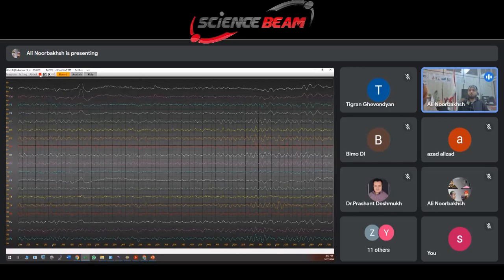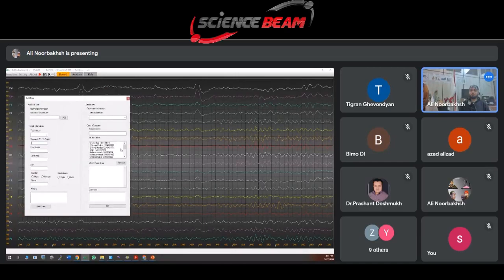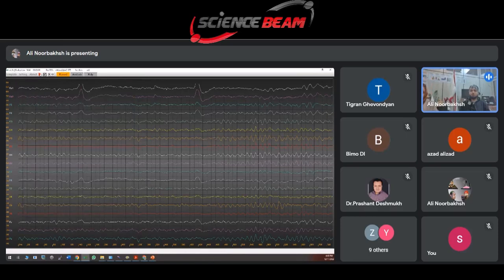After that, we should stop, and then we should go to this page. Again, we should select the name of the client, and this is the QEEG. Again, we should write a comment, QEEG and EC. EC means I close. We need two events, okay? Please close your eyes.